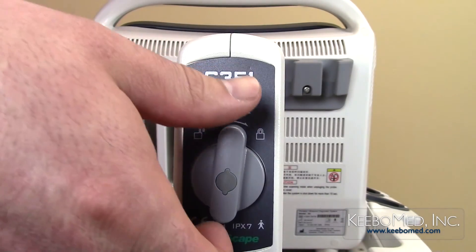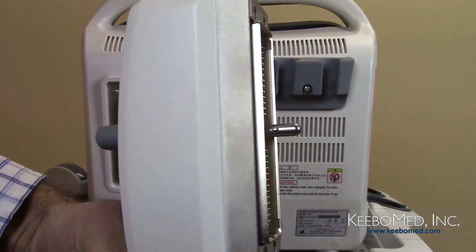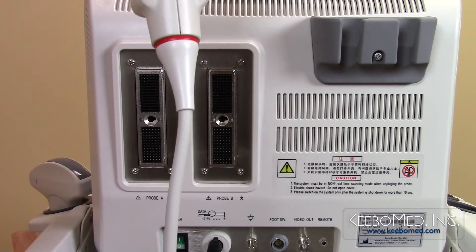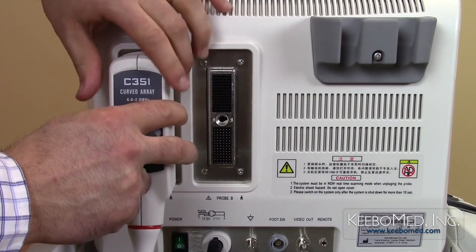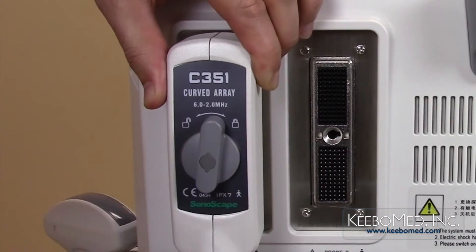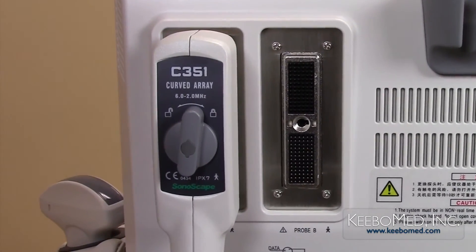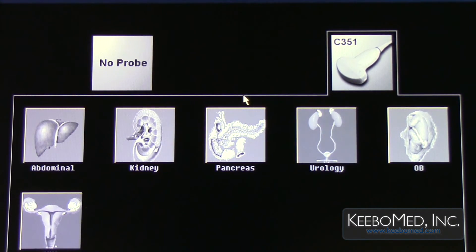Step 2: Turn the probe lock counterclockwise to the unlocked position. The small tongue of the probe lock inside the probe connector will be positioned to the left. Step 3: Make sure the probe cord is facing down and vertically insert the probe connector into the probe socket. Hold the connector and turn the lock knob clockwise to the locked position. Step 4: Check the probe to make sure it is securely connected. The system will automatically detect the probe and display it on the screen.